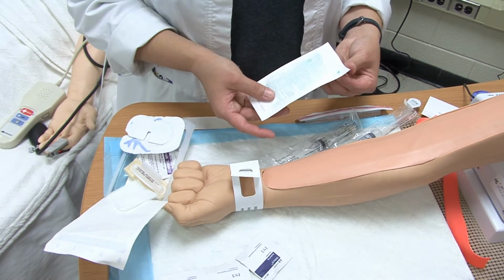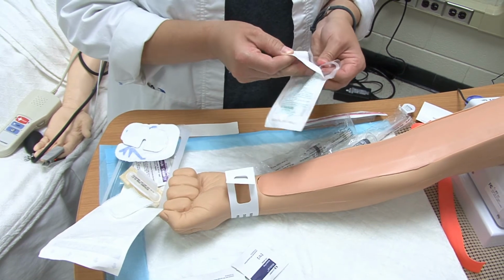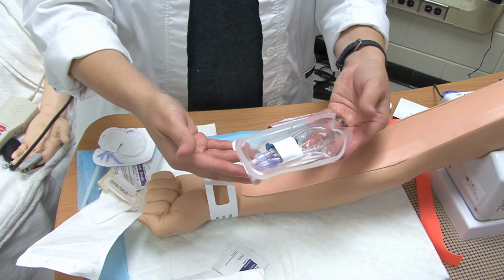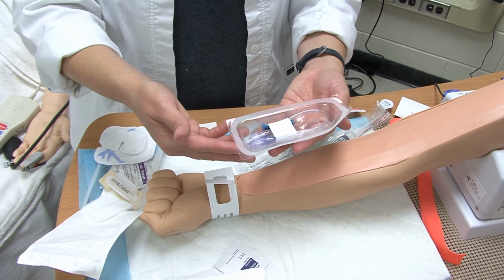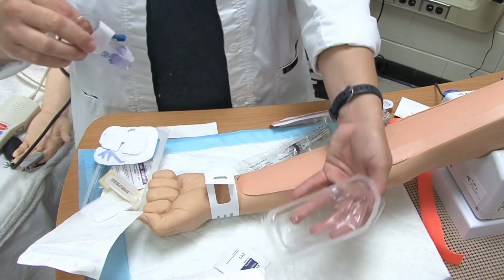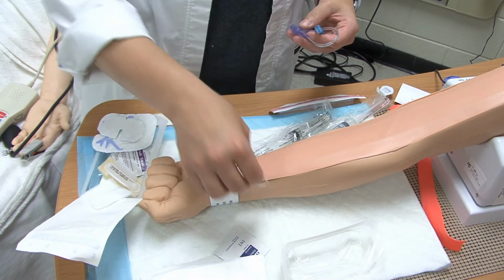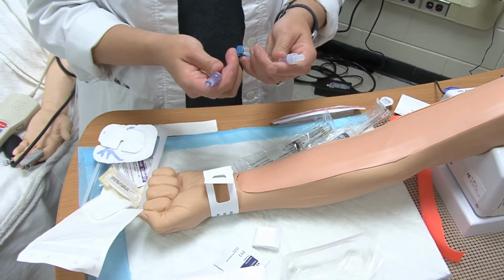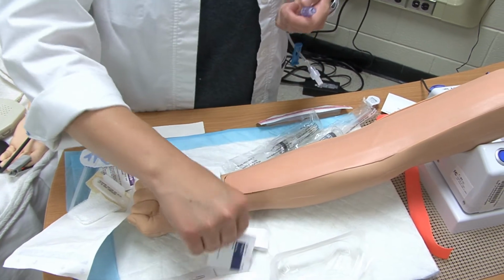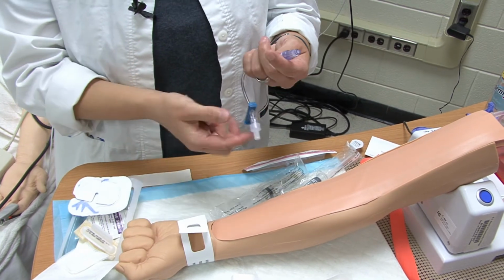Then I'm going to come back to my extension set. Again, clean, dry, and intact. The expiration date is within range. When I open this up, I try to open it to keep the inside as sterile as I can, because when I prepare mine, I like to put it back inside here. So when I take this out, I'm going to take it out without touching anything inside of the little plastic piece here. You're going to assess this to make sure that it's clean, dry, and intact. When I come back to use it, if you are afraid that you have touched this area, then you'll want to swab it with an alcohol swab.